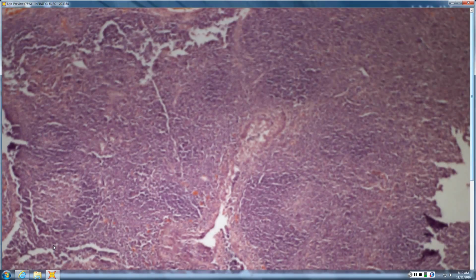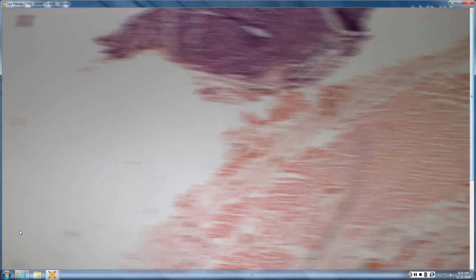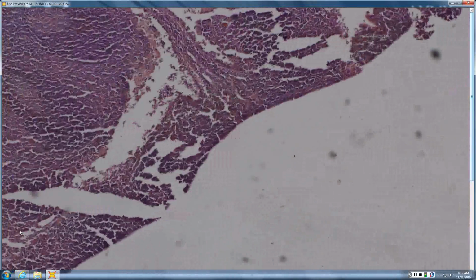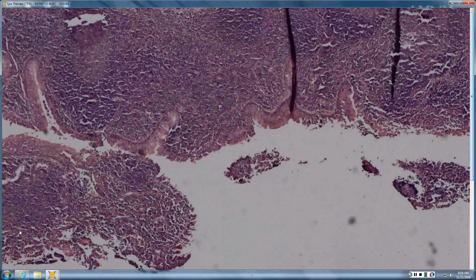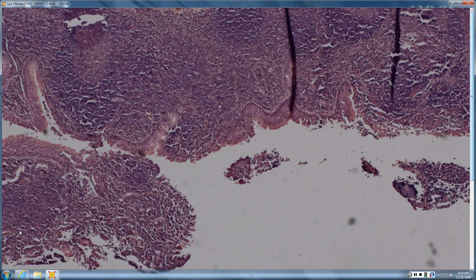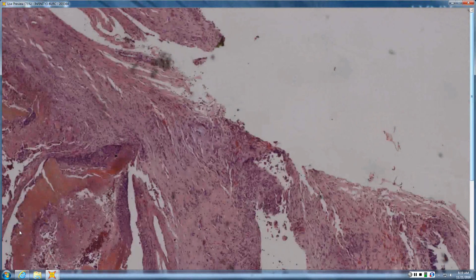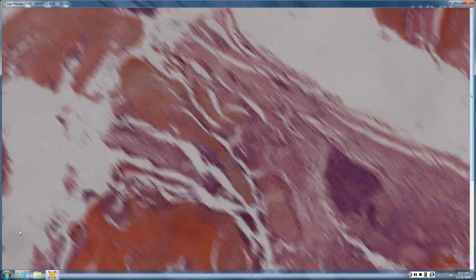Lymphoid follicles, ciliated, like goblet cells, like a bronchogenic cyst. So it's a cyst with lymphoid follicles in the wall, and you do see some goblet type cells. But do bronchogenic cysts usually have big lymphoid follicles? Which one has branchial cleft cyst? They're probably variants of the same cyst. There's a lot of overlap. But with the big lymphoid nodules, we usually call that branchial cleft.